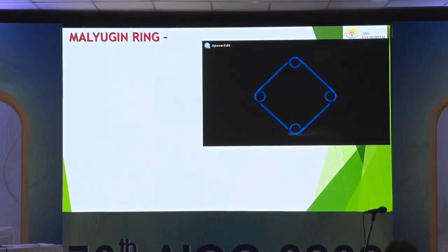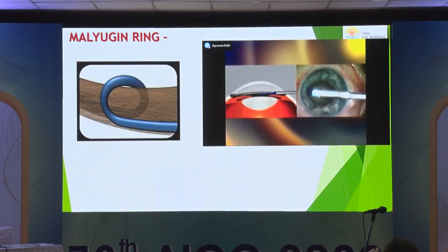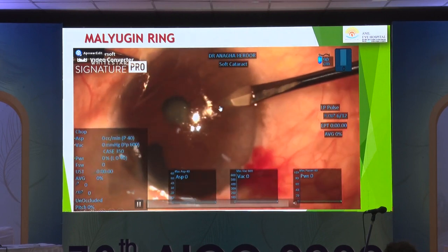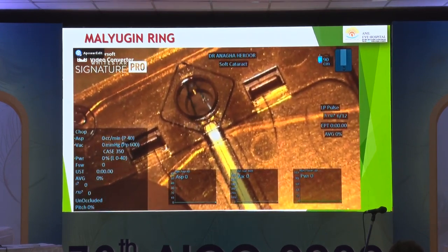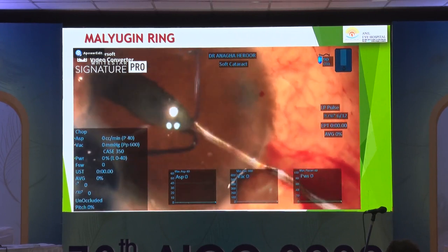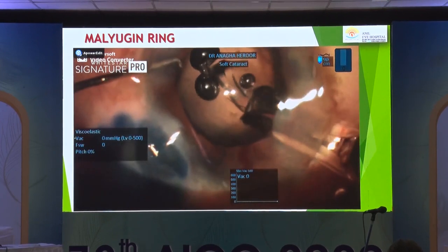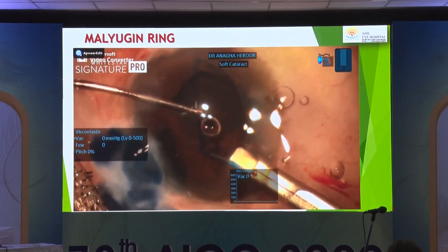The Malyugin ring is preloaded with scrolls that gently hold on to the iris edge. In a one-eyed patient who had lost the other eye due to glaucoma — with a trabeculectomy already done — you hook onto the Malyugin ring, inject it very gently, and the leading scroll along with the proximal, nasal, and temporal scrolls can all be placed in one shot. This provides very good adequate dilatation. An advantage is that it dilates the pupil in the same plane — unlike iris hooks, there is no shallowing of the anterior chamber in the periphery.